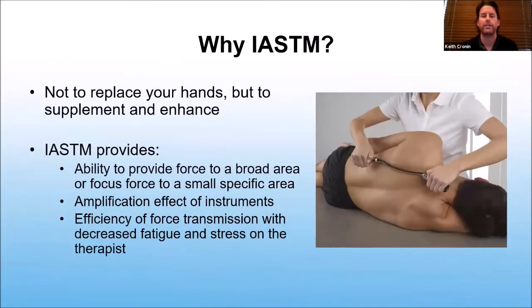So to start with, why instrument assisted? Well, hands can only go so far. We can use these hands to do your mobilizations or manipulations, your soft tissue work. But by using the beveled edge of an instrument, it allows us to get deeper into an area and to be more focused with our treatments.